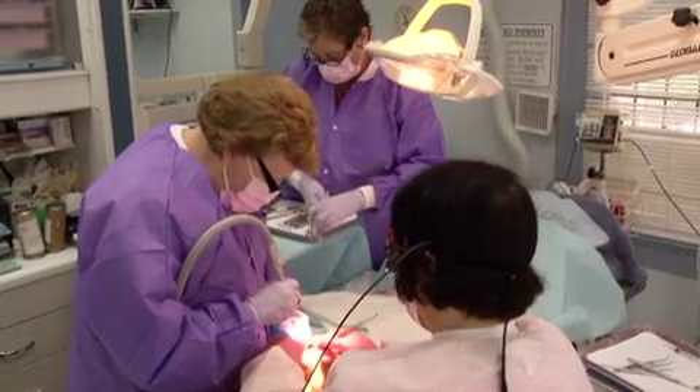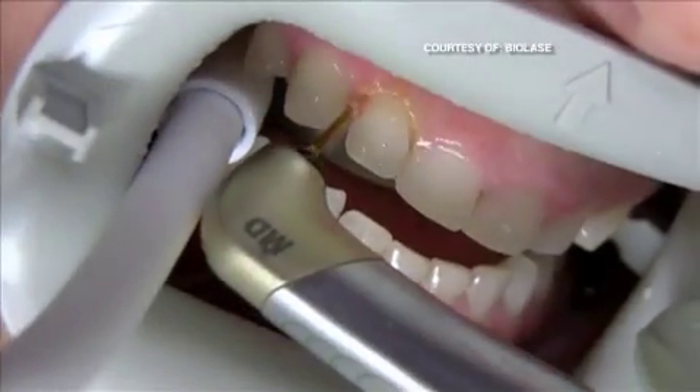It's a sound that sends chills down your spine. But many dentists are swapping the drill for the laser. They appreciate the fact that there's less pain, less swelling, and quicker healing time.